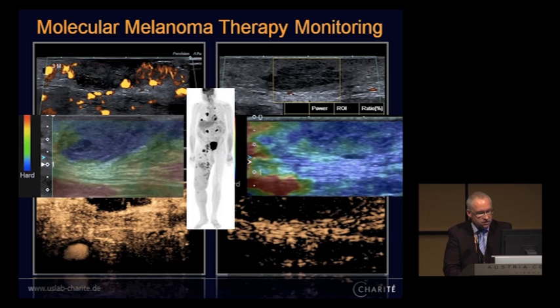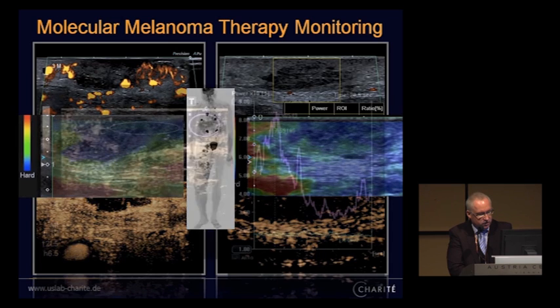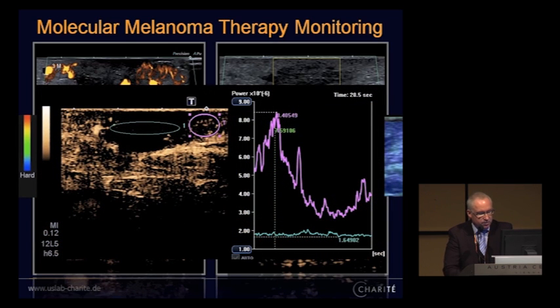This is the situation 3 months later, and we see there's a very low vascularity index of this metastasis, and we don't have any contrast here in the lesion. So a good success of the therapeutic option. This is the metastasis before in the elastography, and we see a big rim sclerosis of this lesion and a softer central portion of the lesion after therapy.